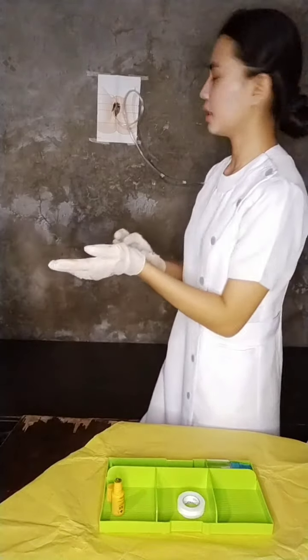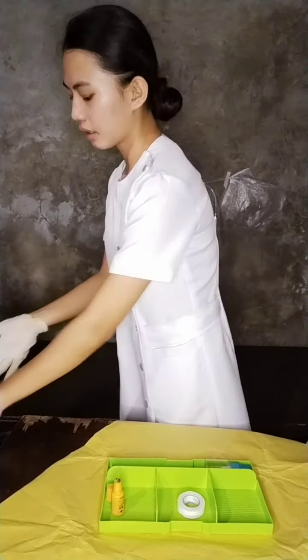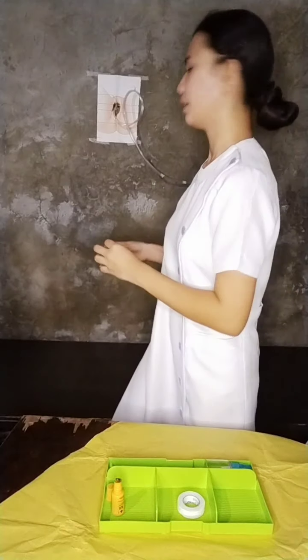So after doing that procedure, you need to discard the sterile gloves and then document all the data that you have gathered. That's all.